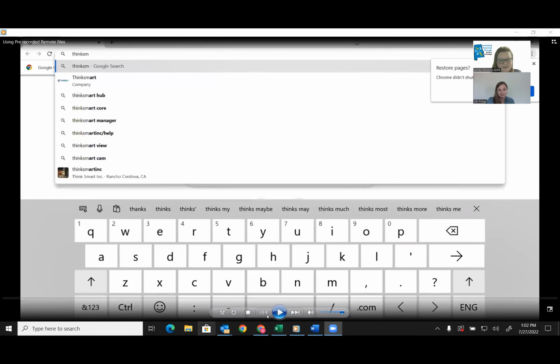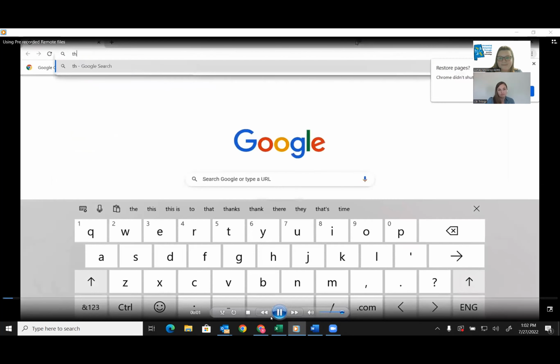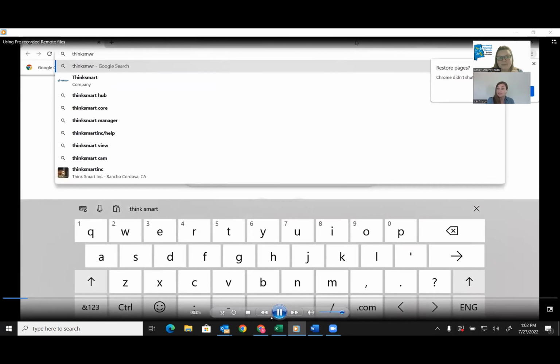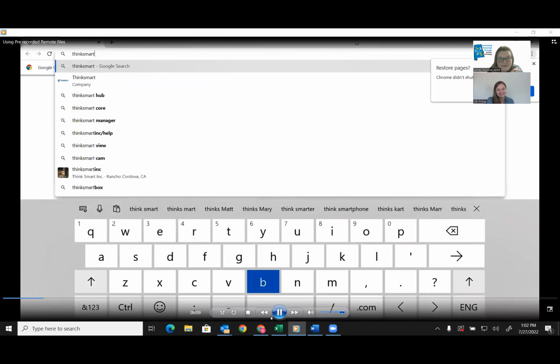Share this. Okay, so here's the video of how you would go through and download one of those pre-recorded files for your remote. And then you don't have to go through the trouble of programming every single button to the device. They've done the hard work for you. Yes, they have. SmartBox did this for you.